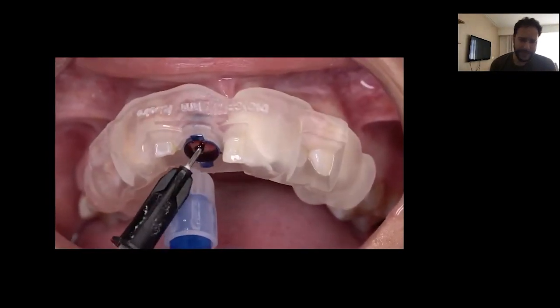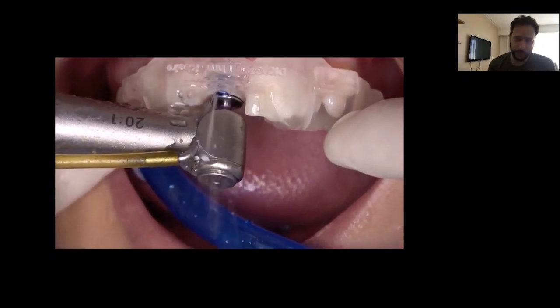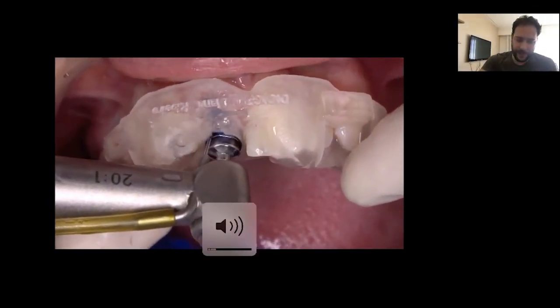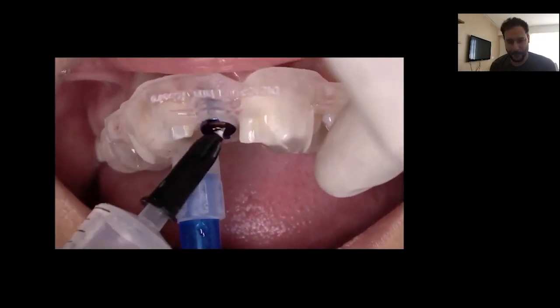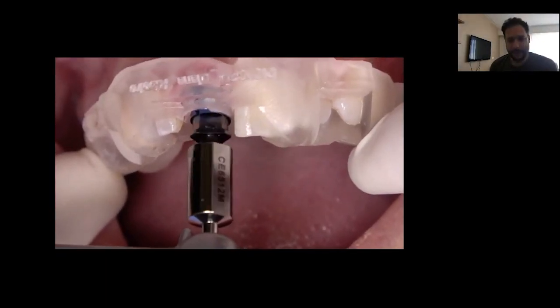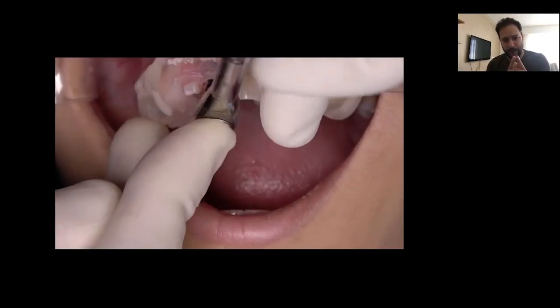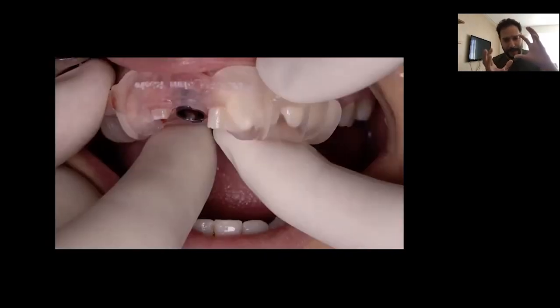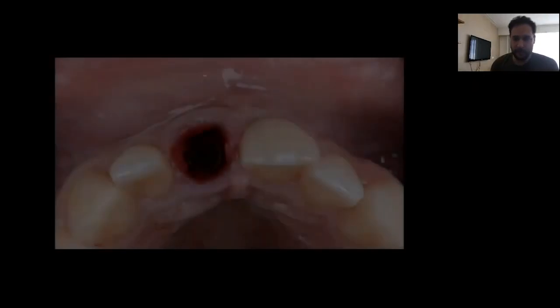You have to drill at very slow speed, as you cannot overheat the bone — using only 50 rpm and not more than 10 seconds at a time will prevent overheating. At implant insertion, it is very important to match the driver mark with the mark on the sleeve so you provide the correct orientation and your abutment will be connected correctly at the end.